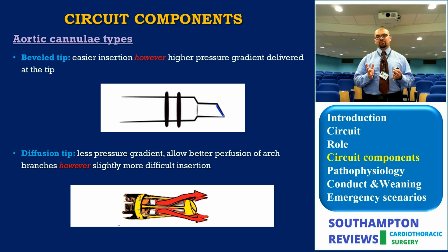Yet the diffusion tip on the other hand creates less flow acceleration. As you can see here, it creates less flow acceleration, less peak gradient, and is less likely to dislodge atheroma and plaques, yet in the view of some surgeons it's more demanding in insertion. Of course, it's completely relative. If you are doing it every day, it will be easy in your hand. If that's the cannula you use every day, it's easy in your hand. This is just relative.